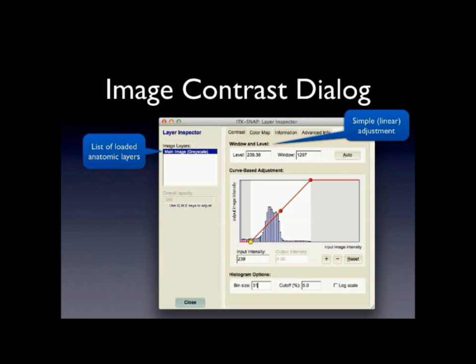Notice that there's an auto button there. That auto button really works 90% of the time. All you have to do is press the auto button. There's even a shortcut, Alt-I, that seems to only work on Windows for some reason.